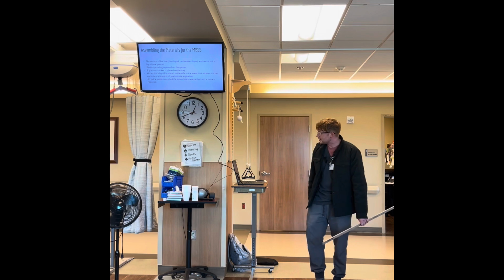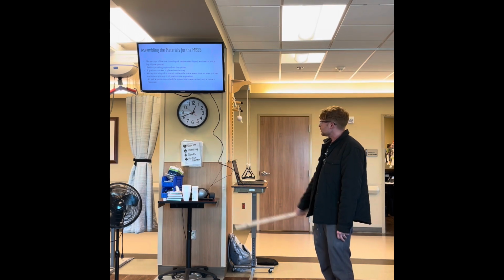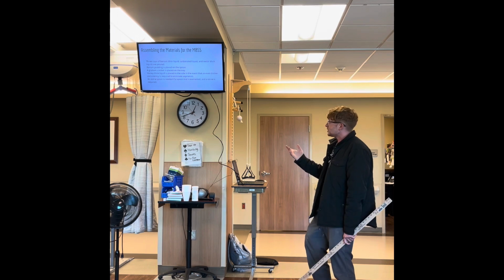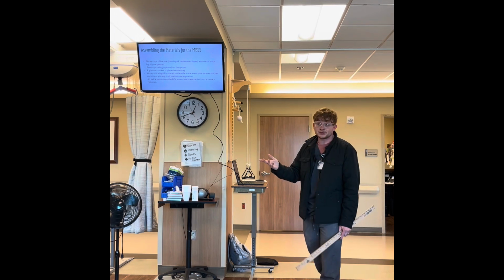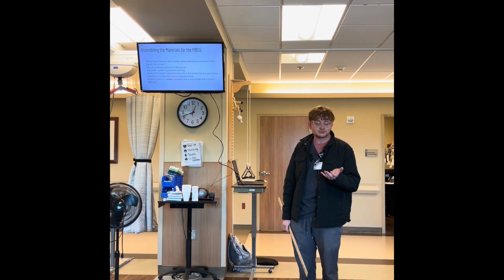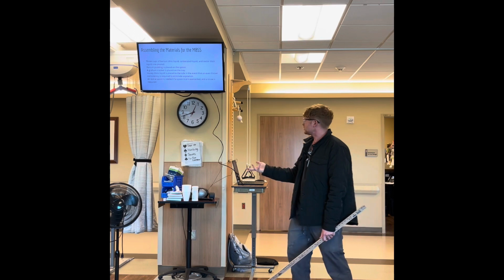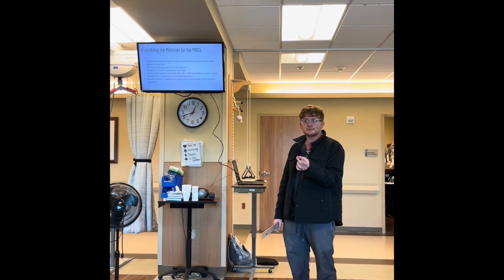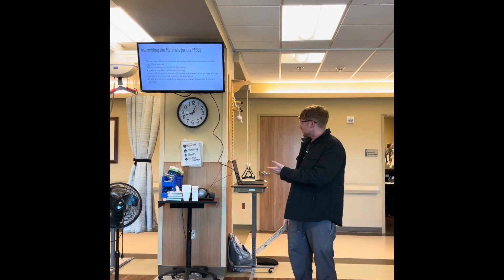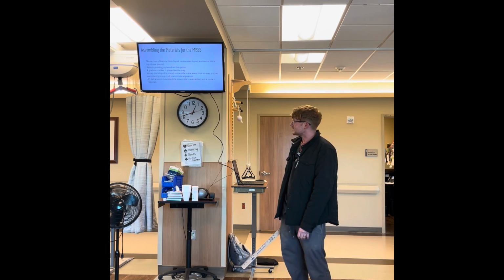So then next we will be assembling the materials. I brought a couple of them. You've got your cups, your barium, the materials you'll need, 3 cups. There's 3 kinds of barium. So there's the regular barium that's just like a thin liquid, water or tea. Then we mix Sprite in one. We have nectar thick liquids there. Think about a milkshake consistency. Doesn't taste like a milkshake, but that's about what the consistency is like.